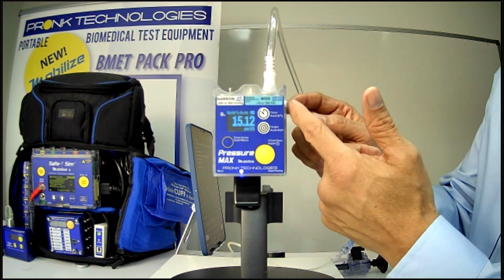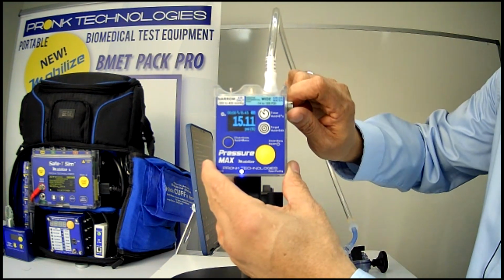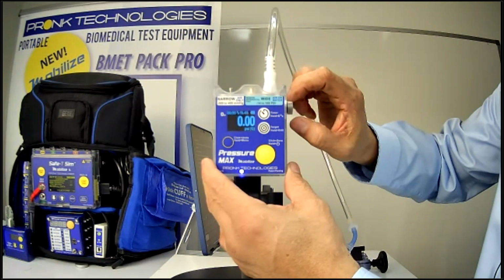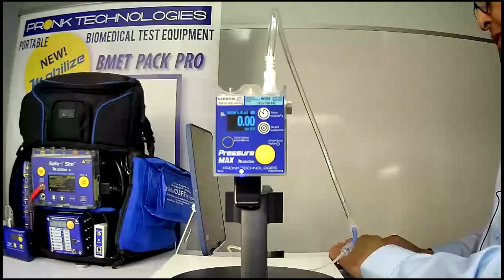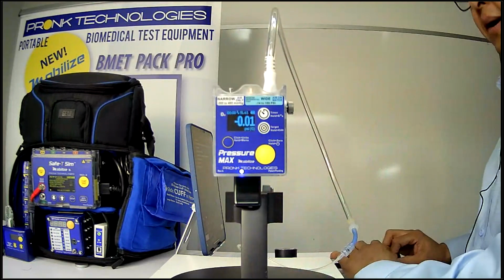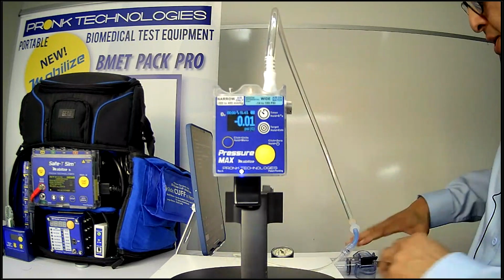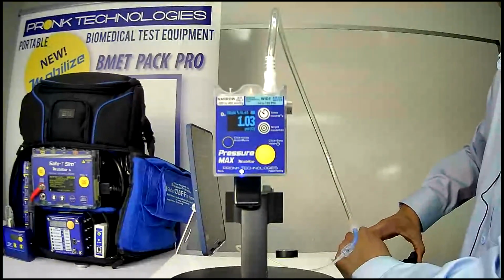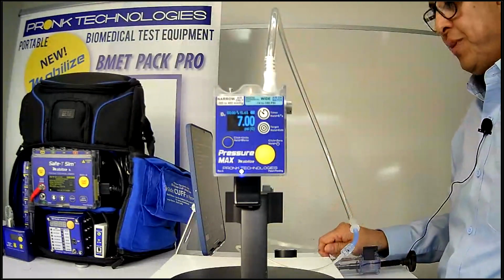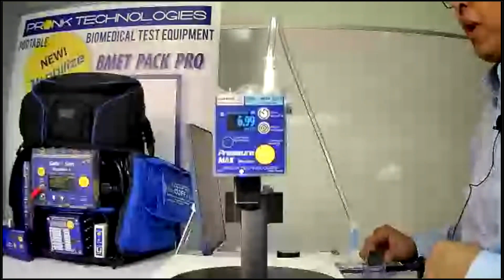And if I ever needed to bleed the fluid out of there, or you want to bleed the air down, no need to disconnect. You could just bleed it from here and use it to tune the pressure if you wanted to, or just reset it back to atmospheric. And then you can pressurize it again to do that. So I can open it back up. I'll go ahead and close it again, and then I can repressurize the system and take another measurement. So it really is useful and makes it easy to make those pressure measurements, having that thumb screw there to do the bleeding to make sure that you're within the range that you want to be within.